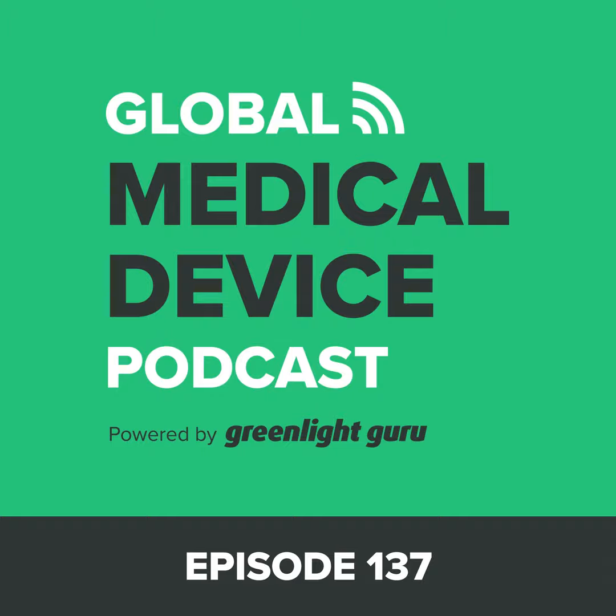Well, I think that's really the key point in all of this, is that embracing the 62304 criteria to help shape your software development lifecycle process not only serves you well from a U.S. perspective, but it also serves you well from an EU and from Canada and Australia and basically anywhere in the world that you're planning to introduce your medical device software. The 62304 framework is going to be good, and you're not going to have to reinvent the wheel. You're going to have to do it once, and you'll be well served for all those markets. Correct.